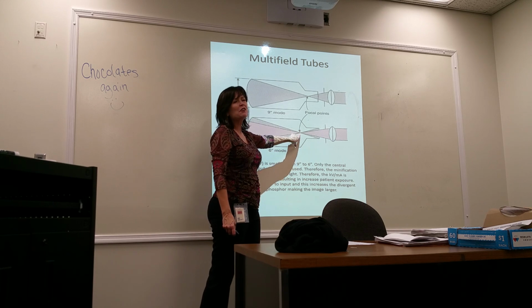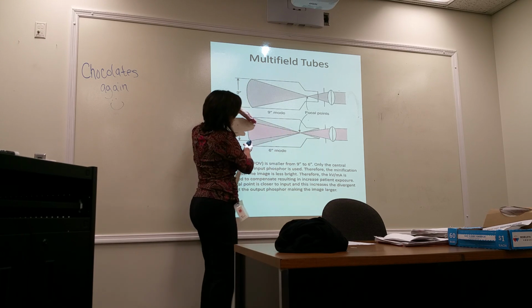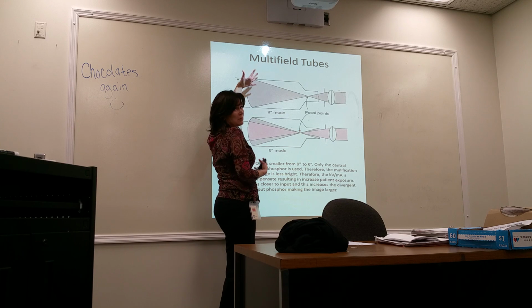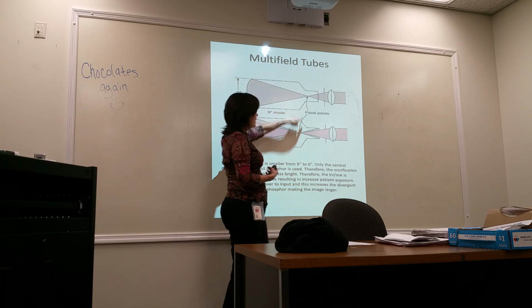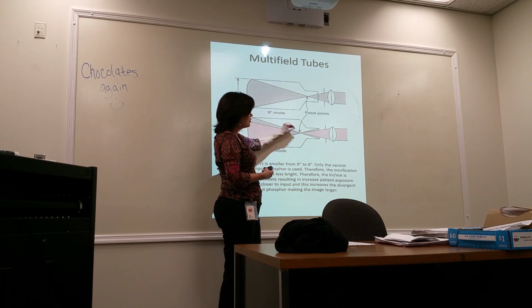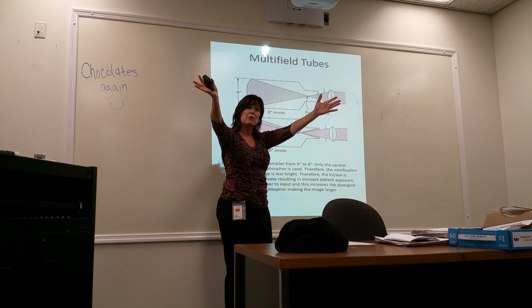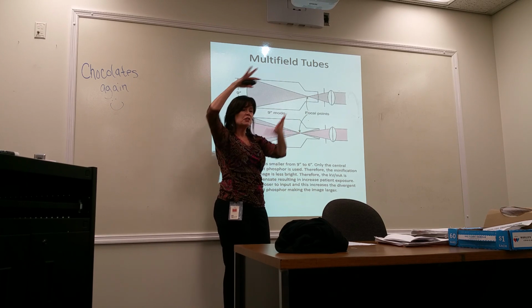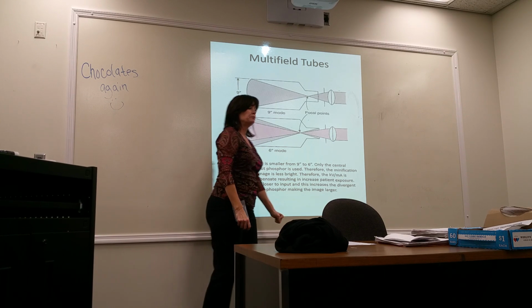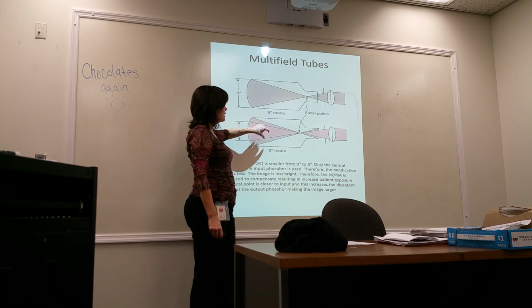Okay, so the focal point crosses sooner. The electrons are coming across. Here's a 9-inch and 6-inch. So this would be the normal mode, and then here is your magnification mode. The focal point crosses sooner, so therefore the divergence of the beam is more, bigger, wider. So that's why the image is larger. So you can have 12 normal, then go to 9, and then go to 6.